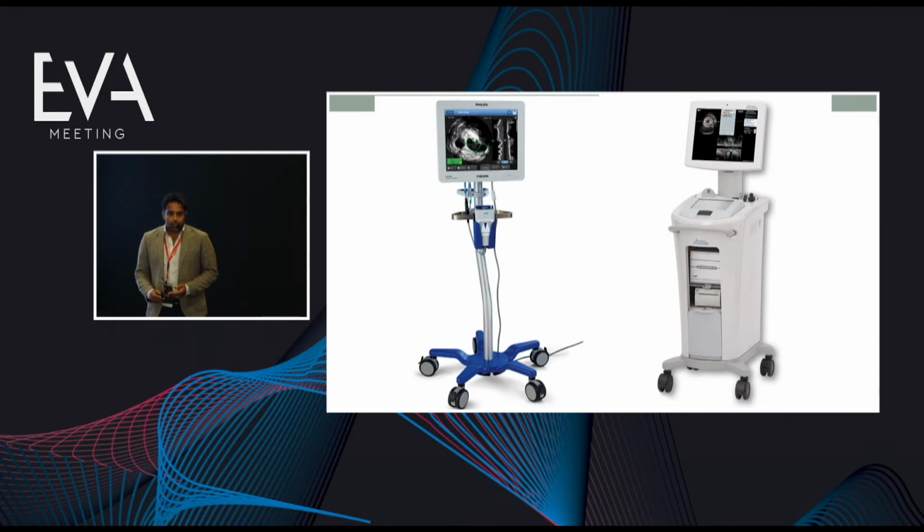There are at least two devices out there. The one is by Philips, the Volcano device, and another by Boston Scientific. So there are options for devices. There are pros and cons for both, but in essence, they both provide exquisite imaging of the vein wall and surrounding structures.